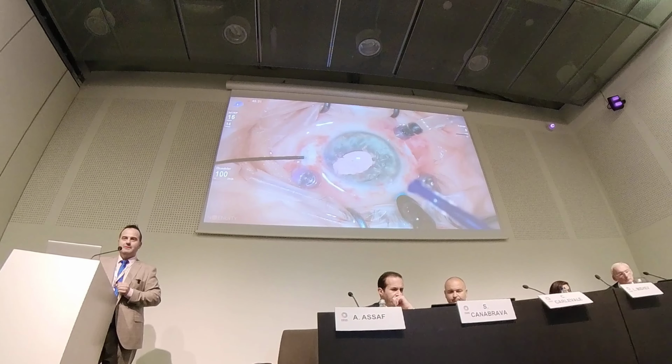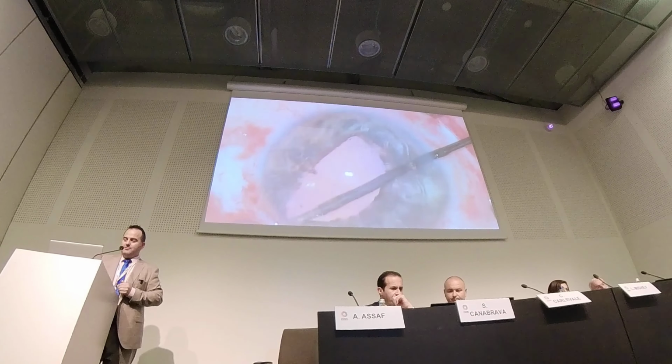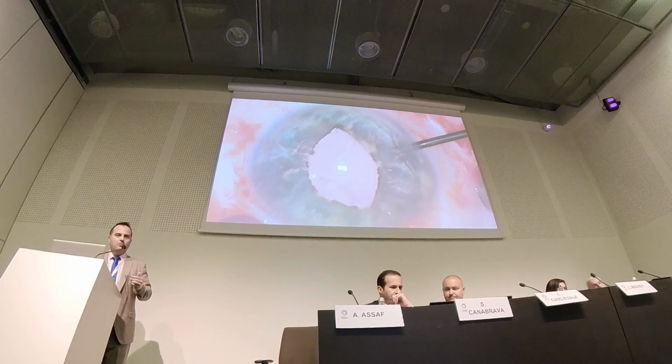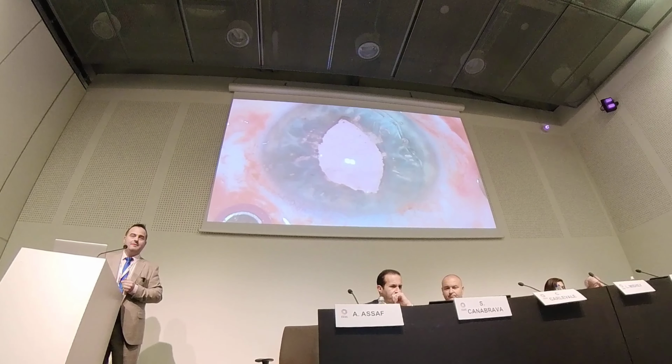You have 4 haptics actually, plus 2 anchors. The aim of these haptics is to sit on the sulcus, and I can use these haptics exactly the same way as with the AO lens. Here you can see that there is no trailing anchor.